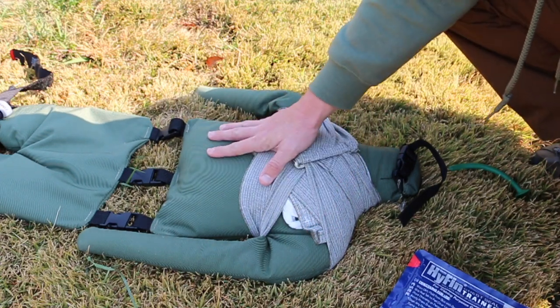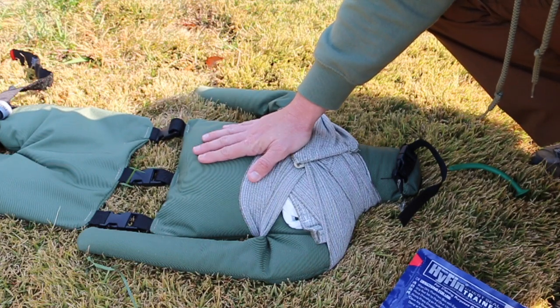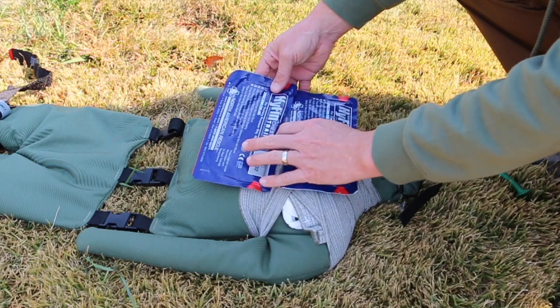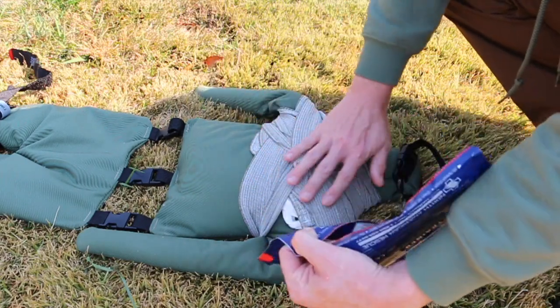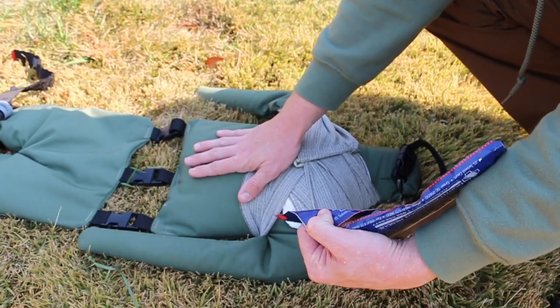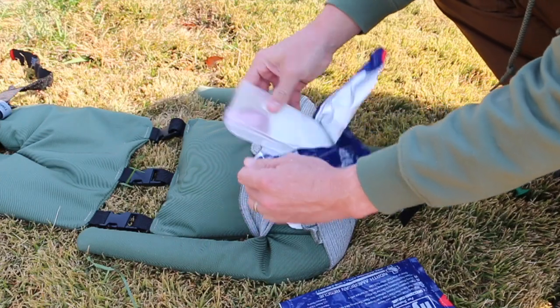But here there's nothing to push against. Everything just moves around. So the best thing we can do here is seal it up. So we're going to use the Hyfin chest seals here. This is the vented, like I said. So they come in a dual pack. This is going to be for penetrating trauma. So we've got a hole in the chest that we want to seal up so it doesn't become a tension pneumothorax. So we pull the red tab.